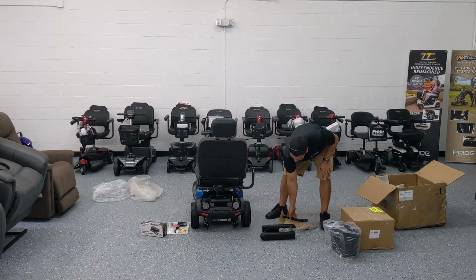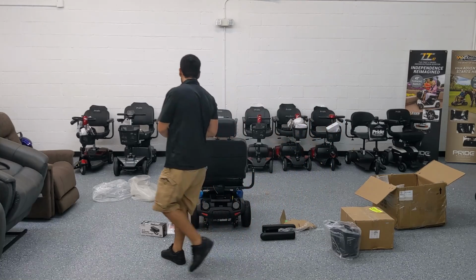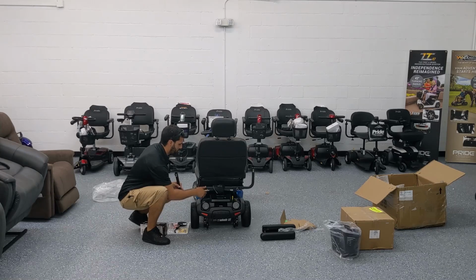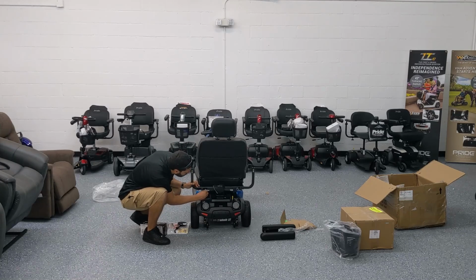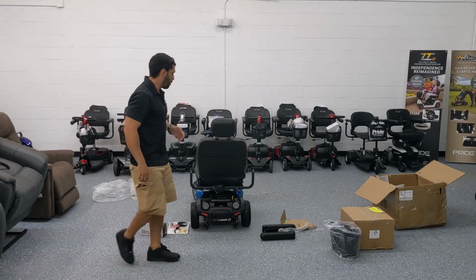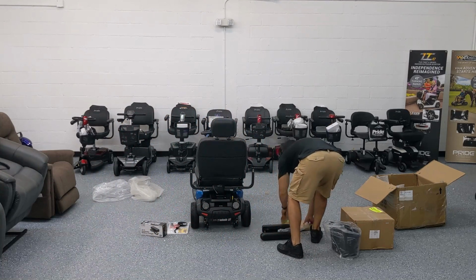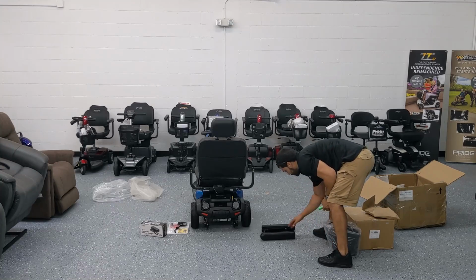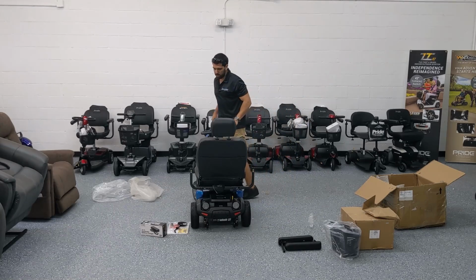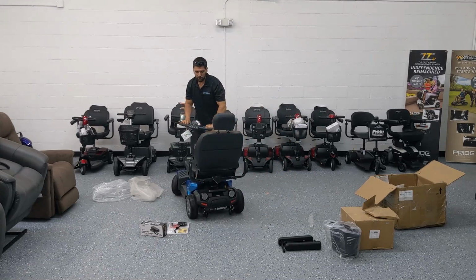Do the same on the other side. The great thing is there are no tools required for this job. You're going to loosen the knob, take out the pin, and then put the pin back in with the elbow inserted. Go ahead and give that knob a twist, and we're pretty much almost done with the armrests installation. I'm going to go ahead and turn the scooter to the side now again so you can see just how easy it is to work with these armrests.